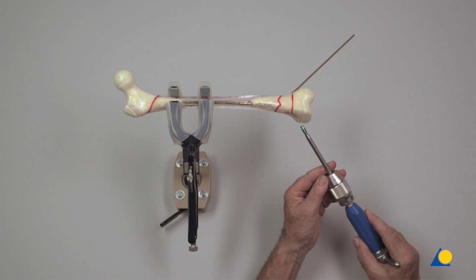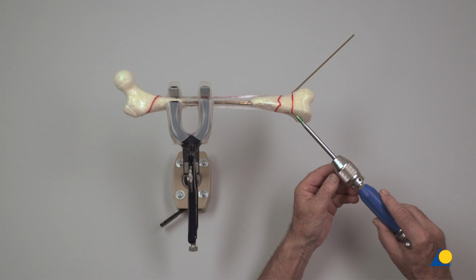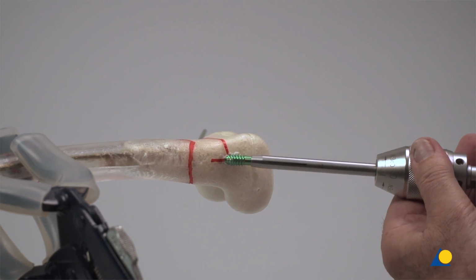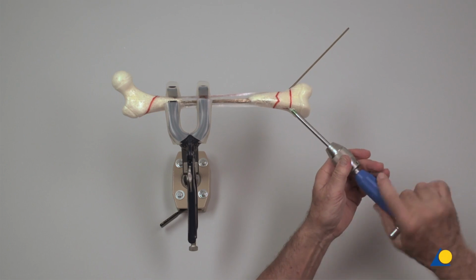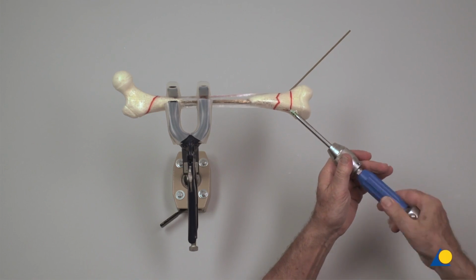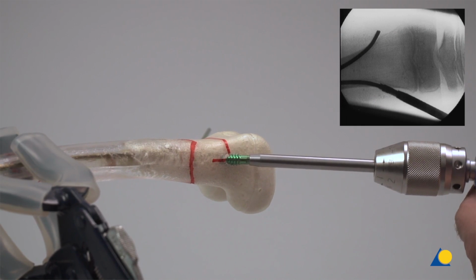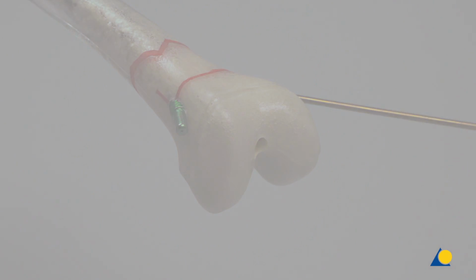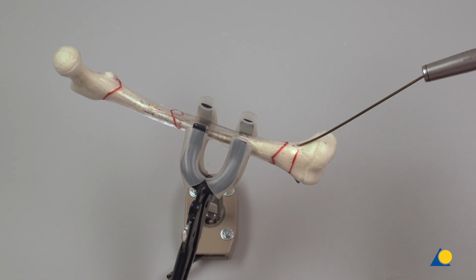The end cap is mounted on the screwdriver by aligning the D-flats, placed over the nail end, and threaded clockwise into the bone at the entry site. The threaded portion of the end cap directed towards the bone must be fully inserted. Clinically, the correct position of the end cap must be verified with an image intensifier. The medial nail is cut and positioned in the same manner as the lateral nail.